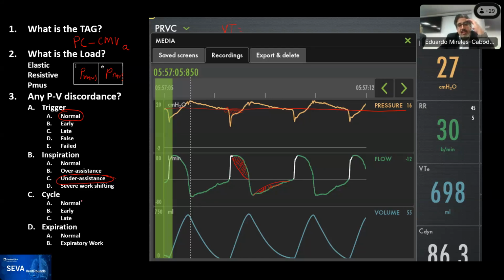And actually, work that we're doing right now is to try to figure out how ventilators behave when we measure this. But I want to demonstrate here. So in this ventilator in particular, you have to do a recording and then go to the recording and do a post analysis of what you did. And essentially what you do is you do a random expiratory pause. So you don't tell the patient anything. You just go and press the button, and when the patient does one effort, then you release it. You just get the first one.